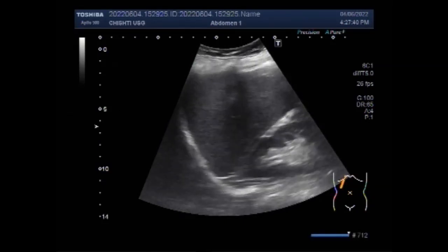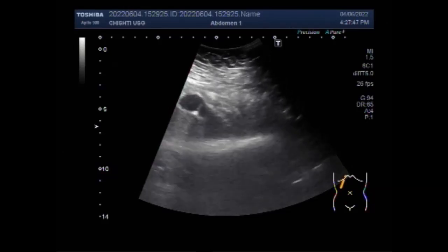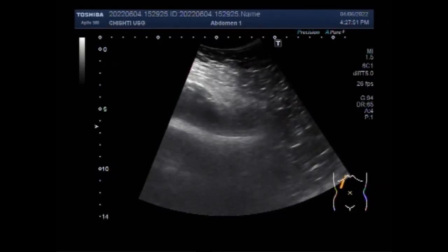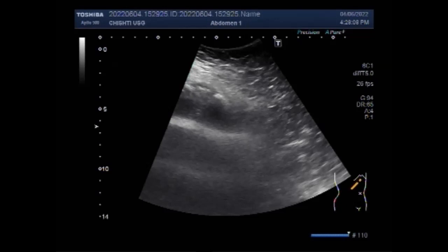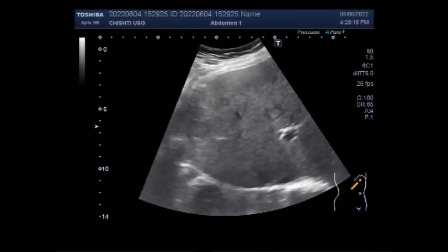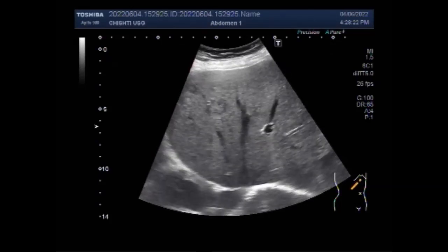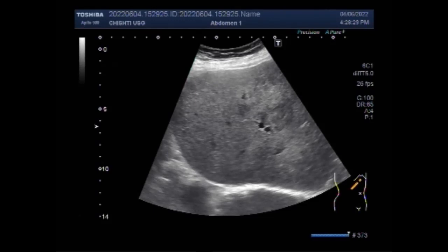Ultrasound imaging features of liver metastasis from the gastrointestinal tract include: bull's eye appearance, multiple masses, irregular tumor borders, arterial rim-like enhancement, and hypo-enhancement in the late vascular phase. A liver metastasis is a cancer tumor that has spread to the liver from a cancer that started elsewhere in the body, also called secondary liver cancer. Primary liver cancer originates in the liver and most commonly affects individuals with risk factors such as hepatitis or cirrhosis.